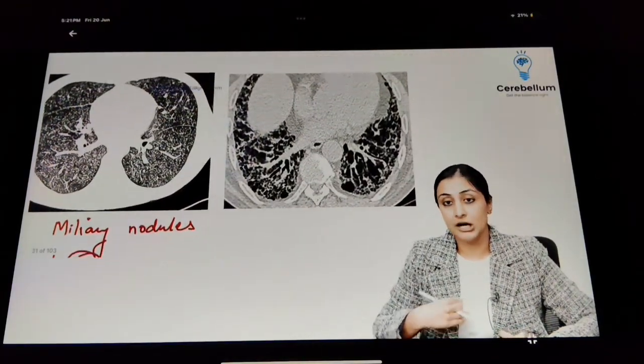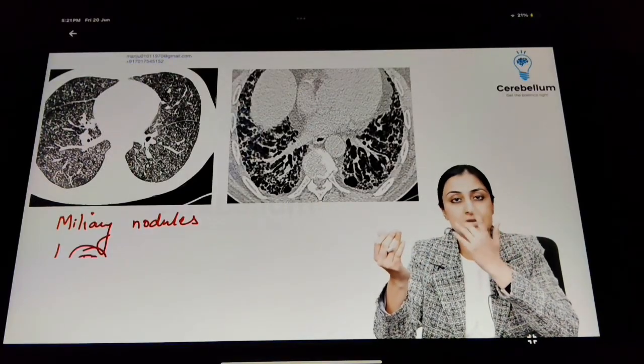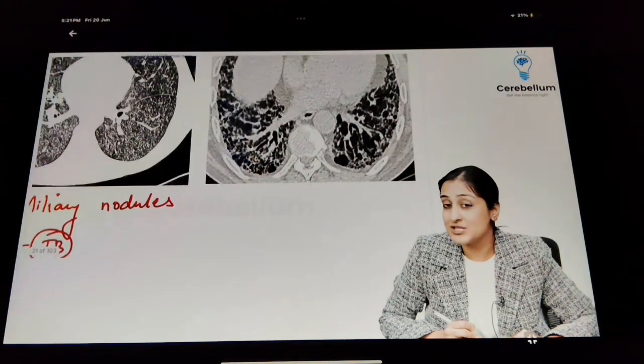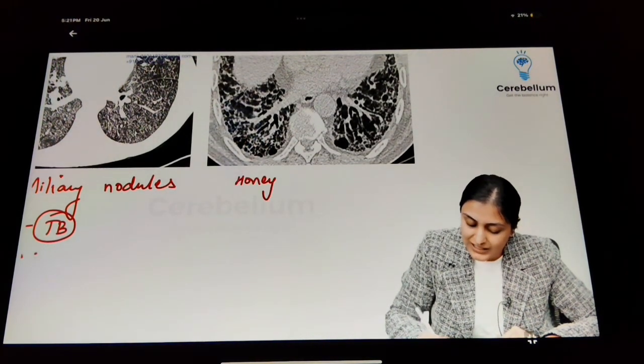This is an interstitial lung disease. They'll give you spirometry findings, they'll give you rales, okay, so spirometry showing restrictive lung disease, and then what you are seeing here on the HRCT, can you appreciate these black things? This is what looks like a honeycomb. There are various cysts which are stacked one on top of the other. So this finding is what is called honeycombing.